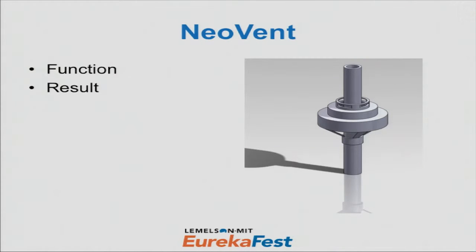For us, about 2 years later now, we've got the NeoVent. Its function, that inverted basket that you see there, captures bubbles, and once it's caught enough bubbles, it becomes light, so it rises. But once it's risen a specified distance, it reaches those windows, it vents all of that air, and so once it's lost the air, it becomes heavy again and sinks. So it catches bubbles, rises, vents, sinks, does that again and again and again.